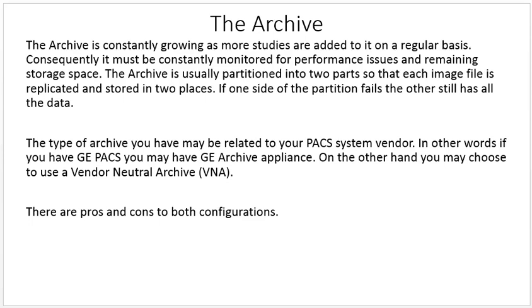So think about this in terms of the real world. There is a hospital in Lancaster that recently went out of business. It used to be called Lancaster Regional. And over the 87 years that they existed, they had Philips PACS, Agfa PACS, and Siemens PACS. So they had on site 3 different archives.